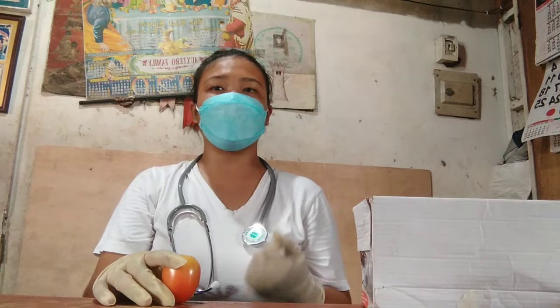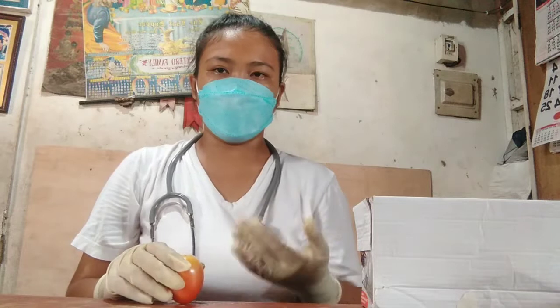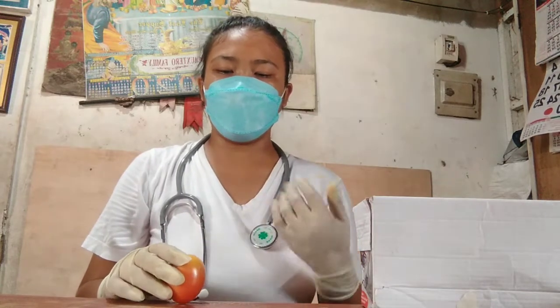The next step is to explain the purpose of the medication, including relevant information about the medication. Explaining the rationale increases the client's knowledge about the procedure and reduces anxiety. Okay, sir, I'm going to inject the medication into your muscle, and this procedure will have an effect. Is it okay with you, sir?